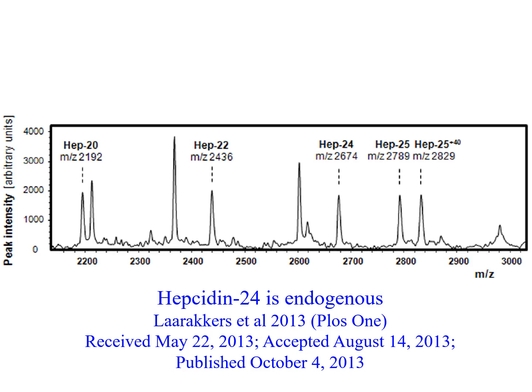They had a much heavier form of hepcidin made that was 40 mass units higher than endogenous Hepcidin 25, and that was necessary because at the time they were using a linear time of flight. They've subsequently moved to using a high resolution reflectron based time of flight, and certainly would be able to make all of their measurements using the 8 mass unit higher heavy hepcidin rather than the 40 mass unit higher.